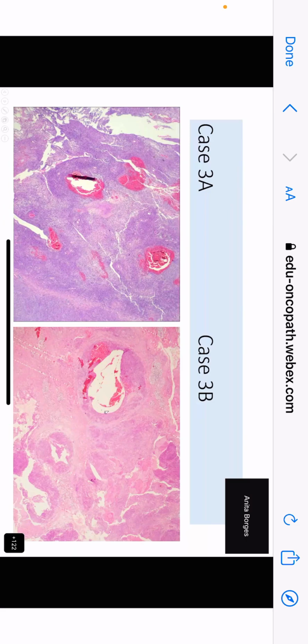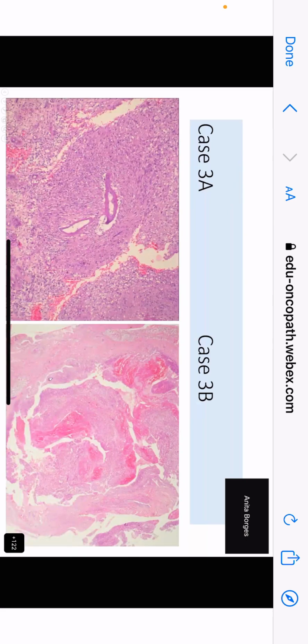Yes, ma'am. This is observationally very, very important. This looks like, on the left-hand side, pure hemorrhagic areas in the tumor. There are spaces. You can see that there is a space even on the left-hand side, but they are not filled with blood. Now, what else do you see? More or less the same thing.